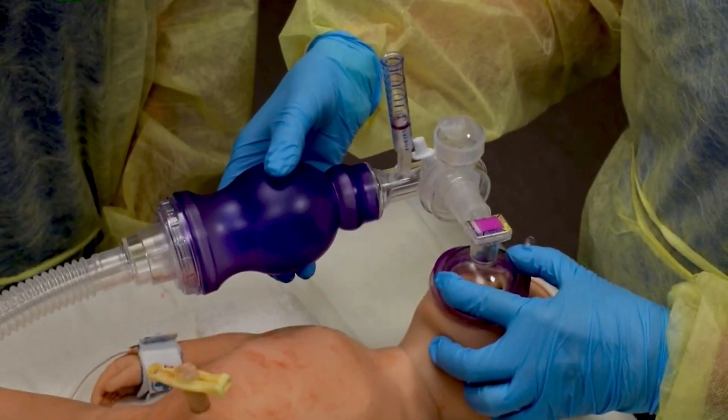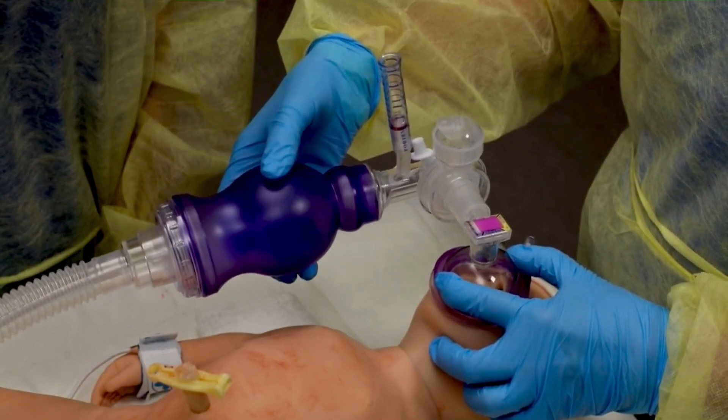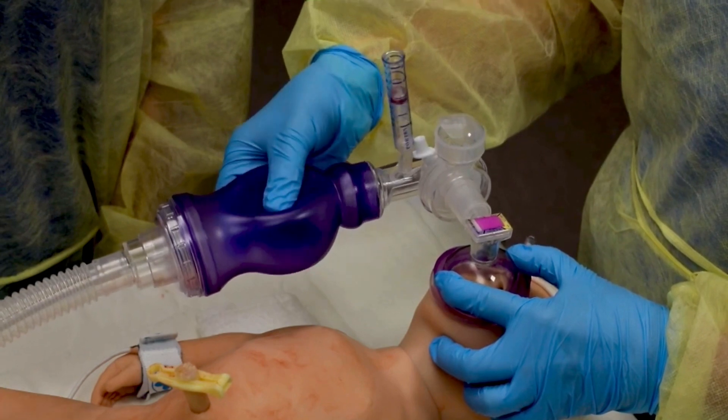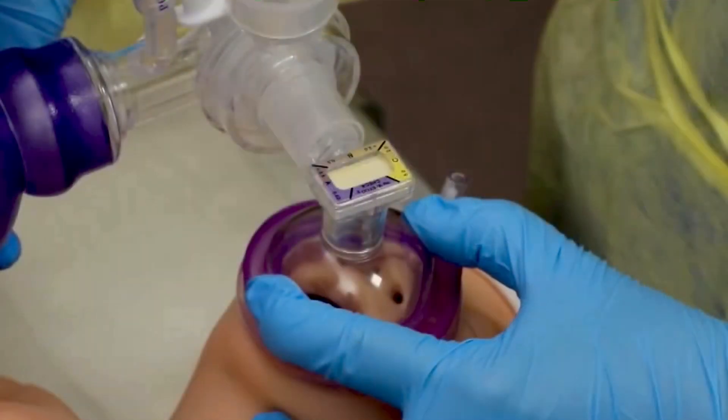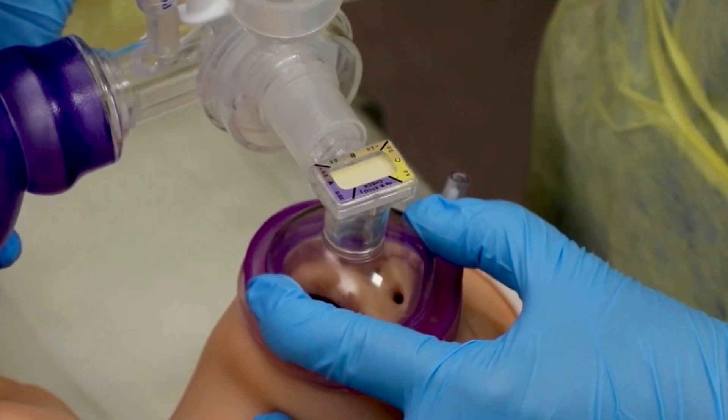A CO2 detector can help identify if the lungs are inflating. Place a CO2 detector between the mask and the PPV device. The CO2 detector should change to yellow by 8 to 10 breaths, indicating ventilation that inflates the lungs.